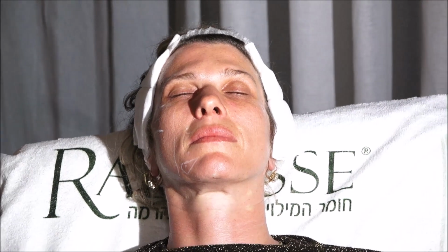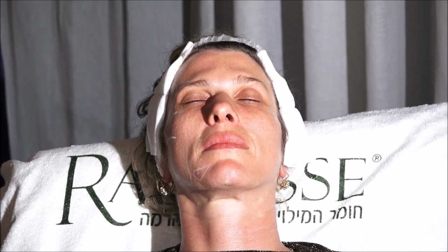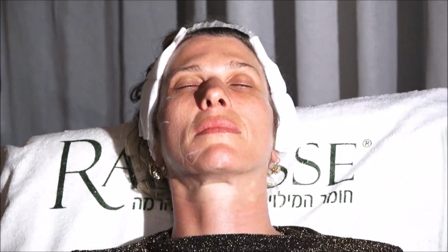Can you give me a 7? No, you don't have enough. Give me the 70 we're going to use for the other Radiesse. It doesn't matter. Yes, thank you. I can use the same. Okay, with 1 ml of the Revive? Yes, yes, exactly.